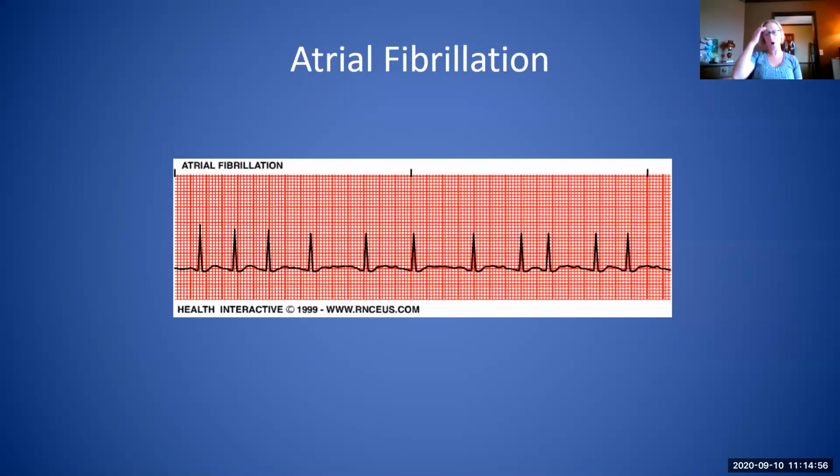So cardioversion is a shock. You're shocking the heart back into a normal rhythm. But cardioversion is very specific to the time when you shock. You're not just going to shock the patient wherever, because as I mentioned earlier, we never want to shock on the T wave. Well, you can't see the T wave really in AFib. So where you need to shock is on the QRS.